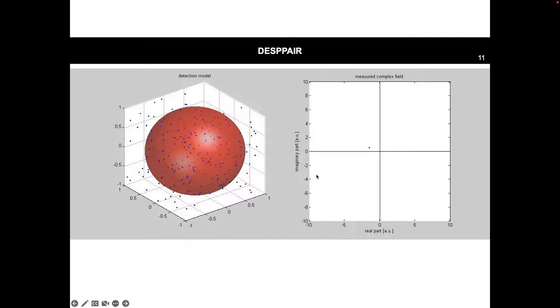Okay, so what is going to happen now if I move that collection of particles, if I translate it through my volume? I don't translate it much. Let's say I translate over this distance. So this whole collection of particles is going to move this much. And it's perfectly perpendicular for this distance, okay? So now I have this particle. It scatters back a certain field, right? If I move it over here, what will change in the field that the particle scatters back?